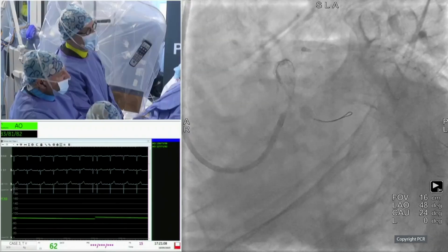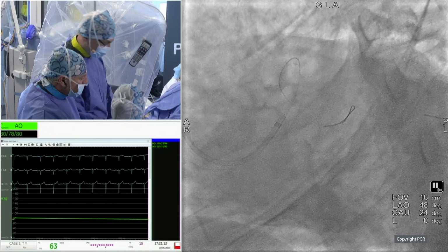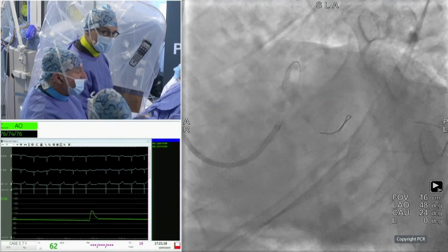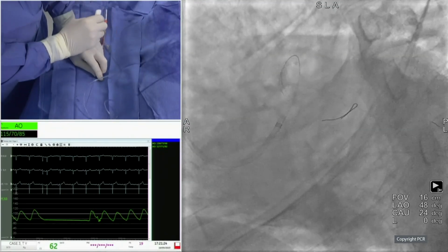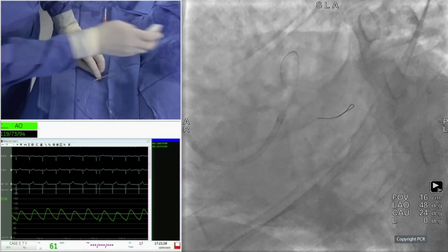In fact, no. For this particular patient, because this patient has mild aortic stenosis, 1.4 or 1.5 centimeters squared. So for the future, if he deserves any TAVI procedure, if we have some protrusion of the stent inside the aorta, the stent could be crushed during the TAVI procedure. For the moment it's not an issue, but maybe in 5 to 6 years.